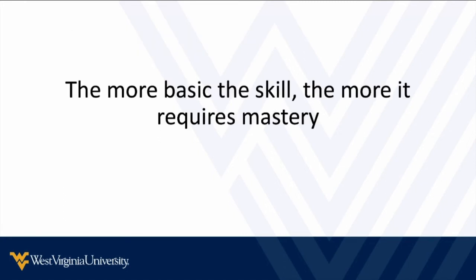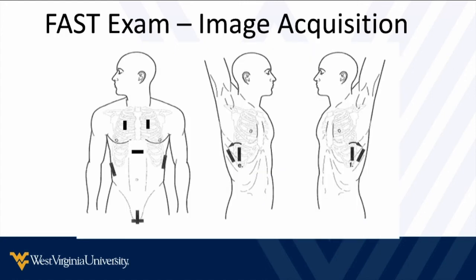And I always like to talk about, we think of the FAST exam as one of the most basic things we do with ultrasound and one of the more basic things we do with trauma. But the more basic it is, the more mastery is required to do it well and to not make mistakes.